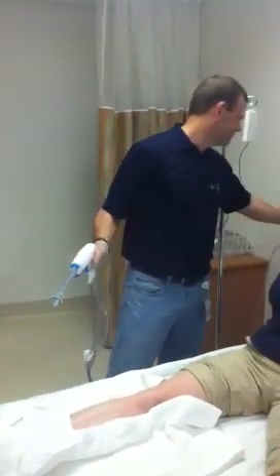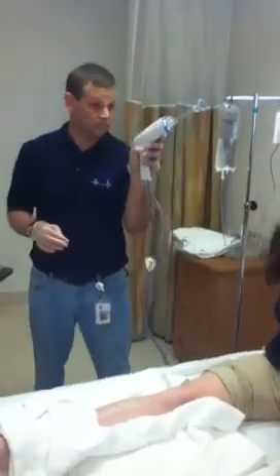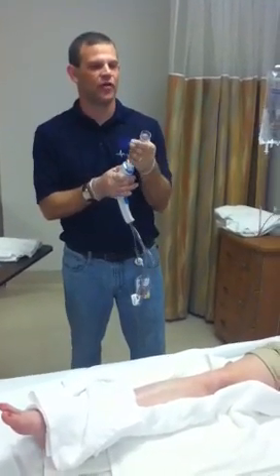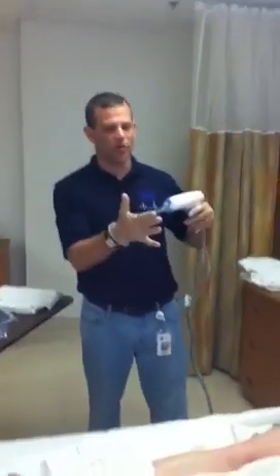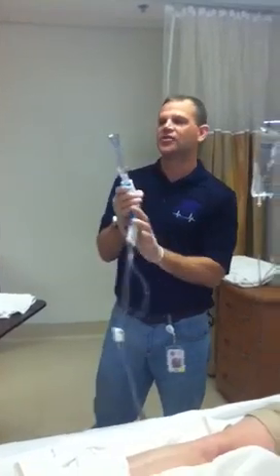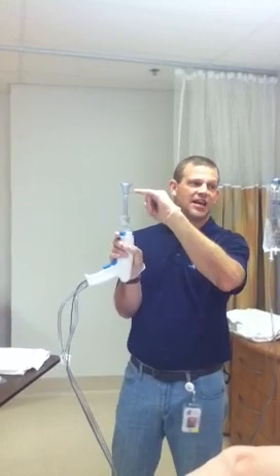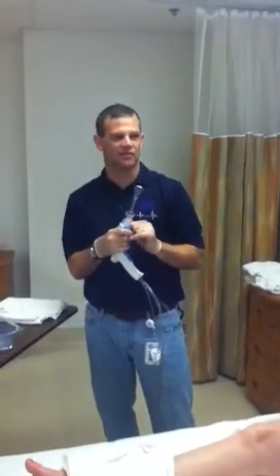There's one thing in the leg — why are there two? The tip of it has a soft version that would just firm it up a little bit, depending on what I'm trying to do with it. Sometimes they want a real firm feeling. I can also, with a pair of sterile scissors, cut this down to make it smaller. There are actually little holes in the side of this thing to help reduce how much suction so it won't suck to the skin as much — but if I turn it up high enough, I can suck more than those two little holes are going to let it escape.